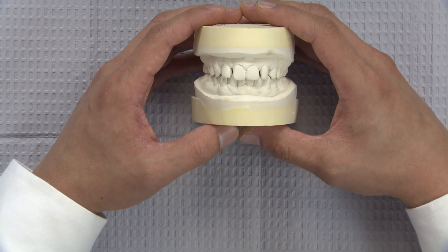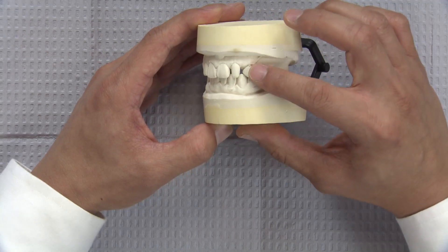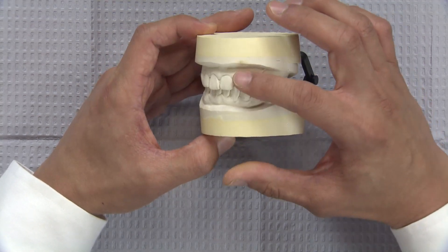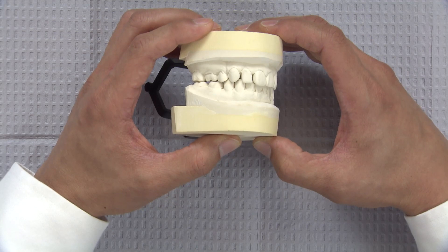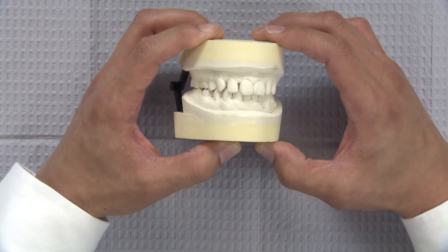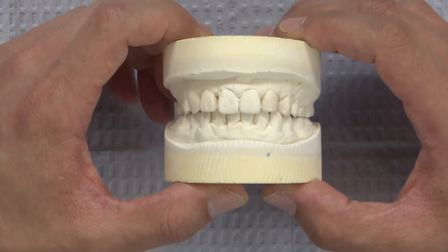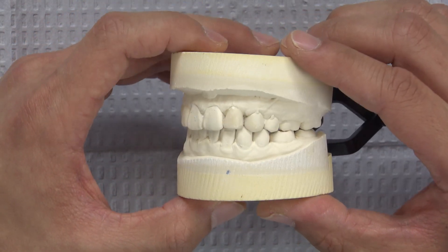For this case, we have a 22-year-old female that presents with peg laterals and also a congenitally missing maxillary left canine, tooth number 11. The patient would like to enhance the aesthetics of her smile by closing the diastemas on either side of the laterals. We certainly have many different options today in dentistry. I will attempt to do this using the most minimally invasive method by applying composite bonding to the mesial and distal surfaces of the laterals. To plan out what we're going to do for this case, I went ahead and poured up a separate model and waxed the aesthetic areas up.